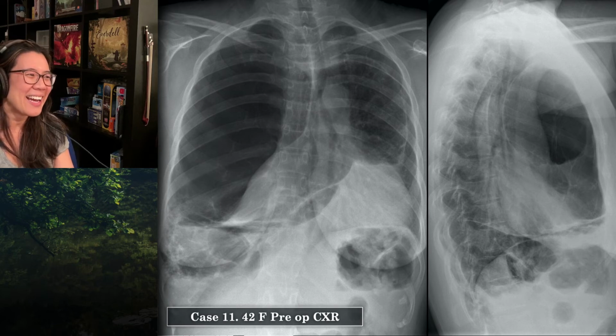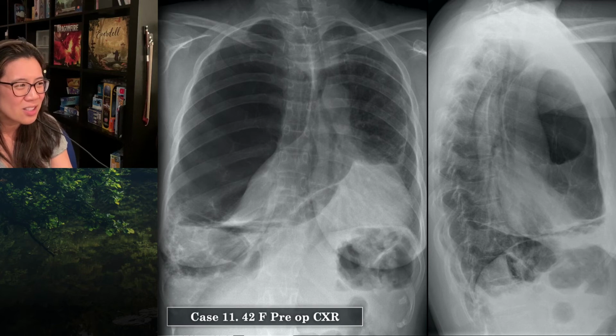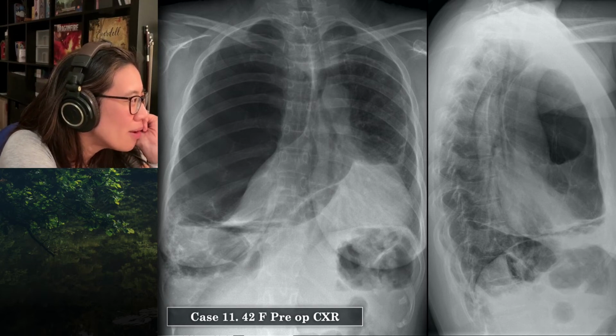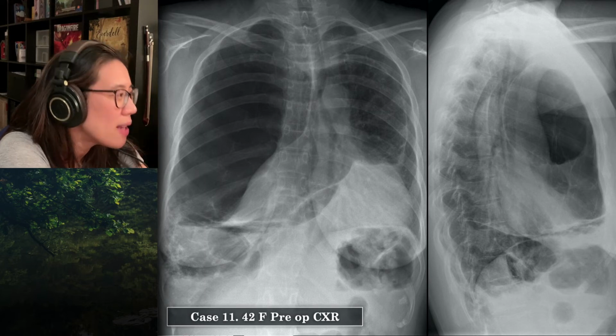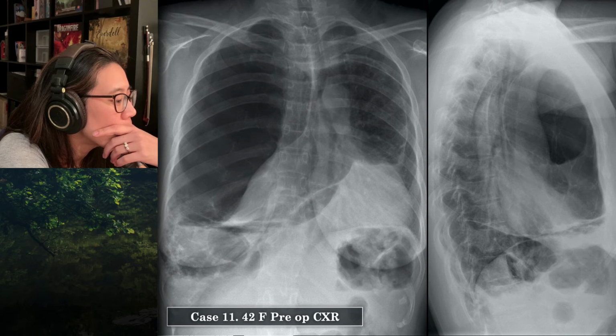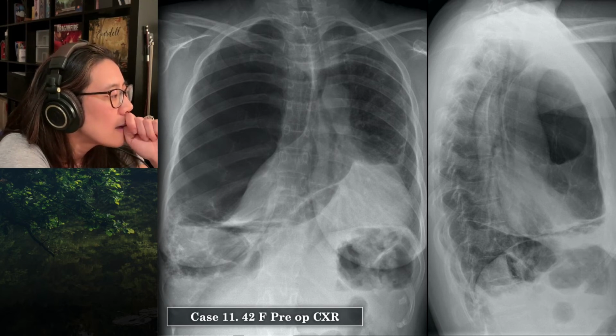On the lateral image in front of the superior mediastinum, you can see that great big lucent part of the lung herniating across the midline. Oh, wow. So this is another tension pneumothorax, is that right? I didn't say that. Okay. You're making me work hard here, Bob. Well, then the next differential, as we said before, would be a big bullous. So it'd be important to know if this patient has got previous chest x-rays for comparison.